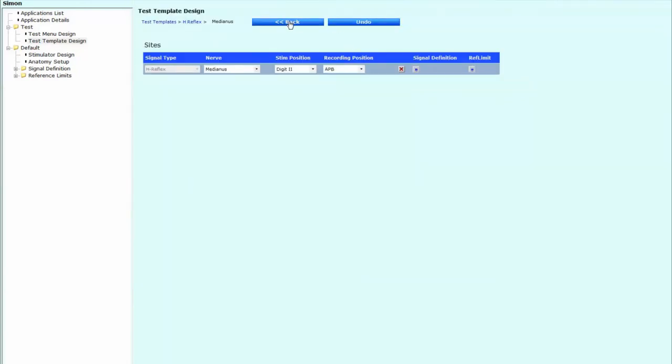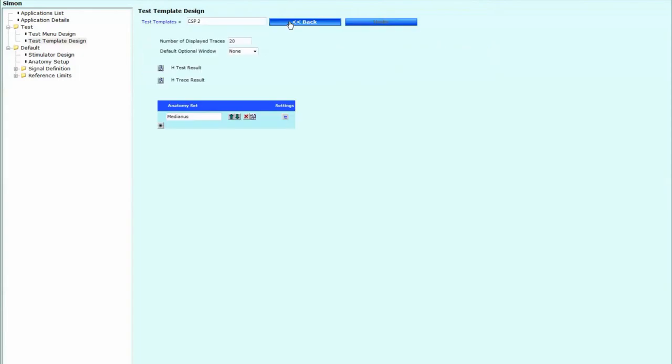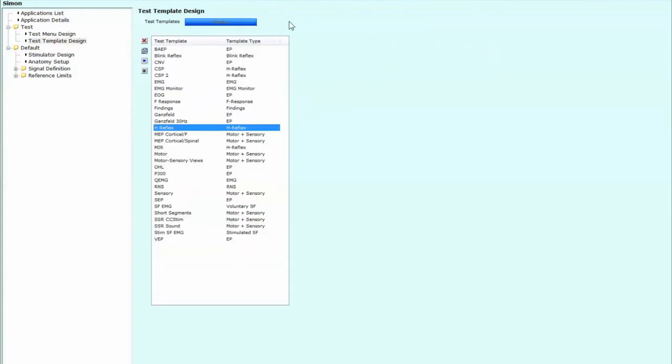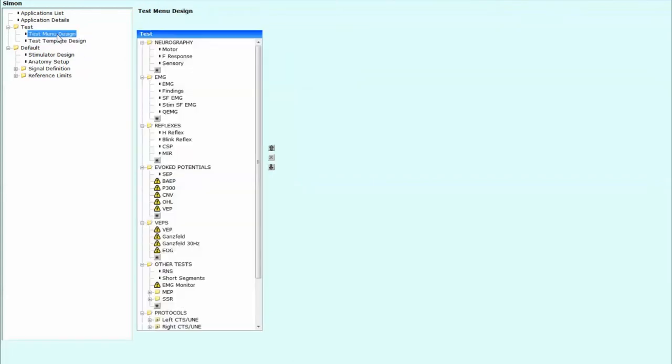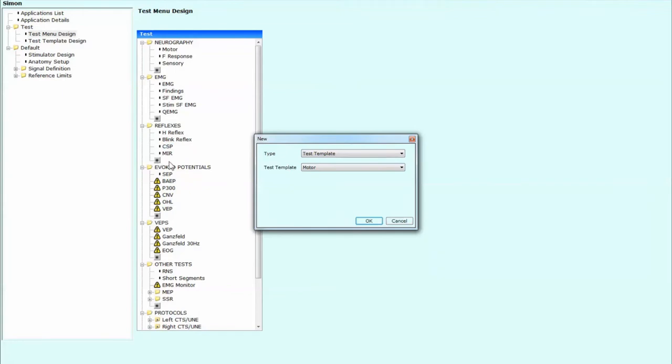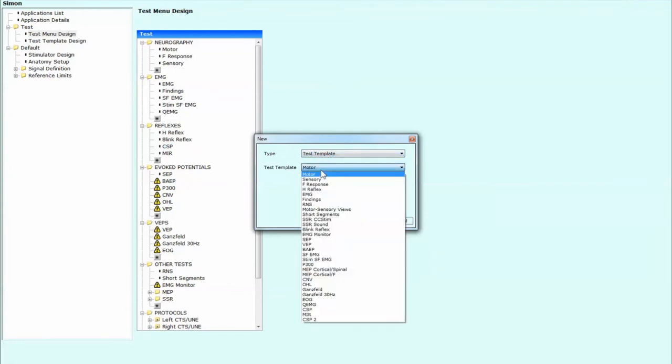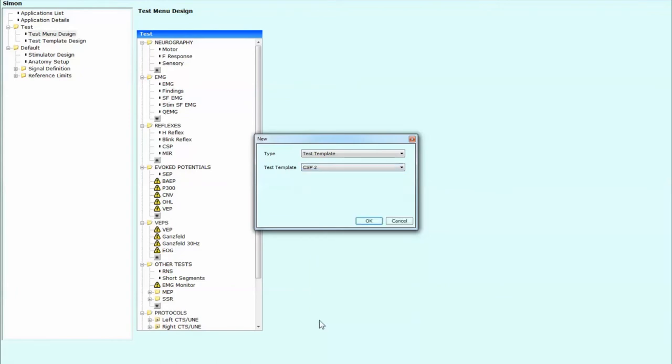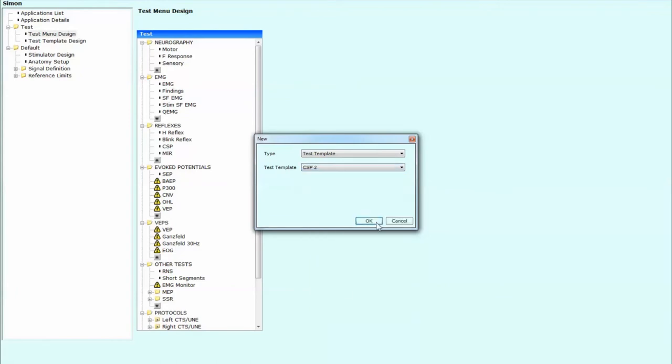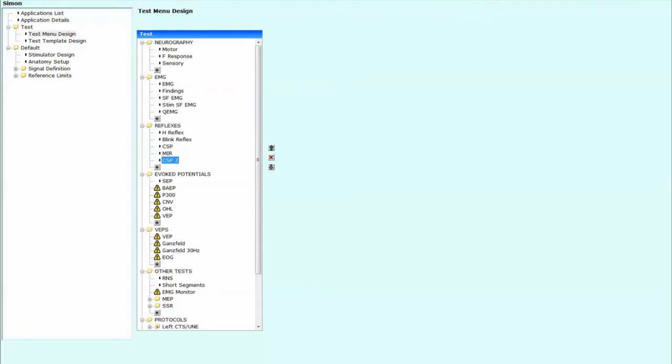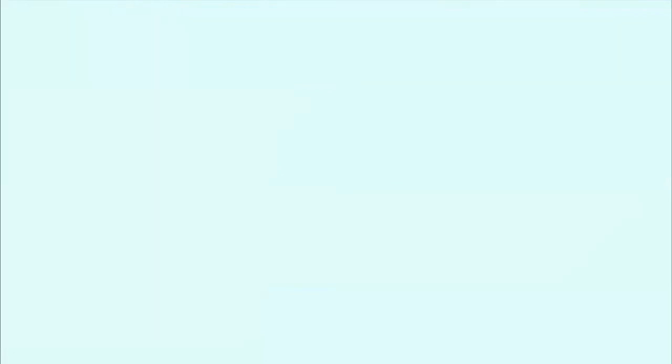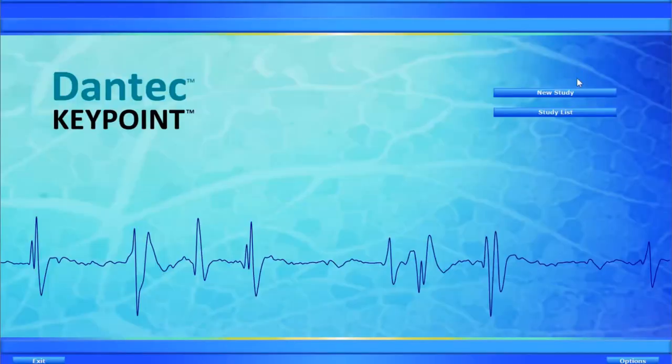Let's move back and back. And over here you can see CSP2 over here like so. Now that we have sorted out the test template design, we now have to go to the menu design. And so let's just pop this with reflexes. I'll just keep it over there. Click on the start test template. And you can see at the bottom of the CSP2. So there it is. It's now in our list. Let's just make sure that's clicked on save.